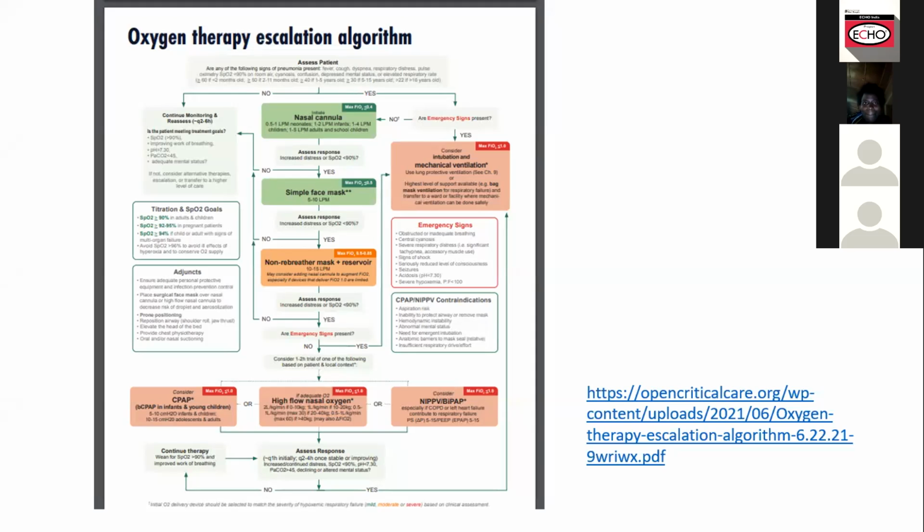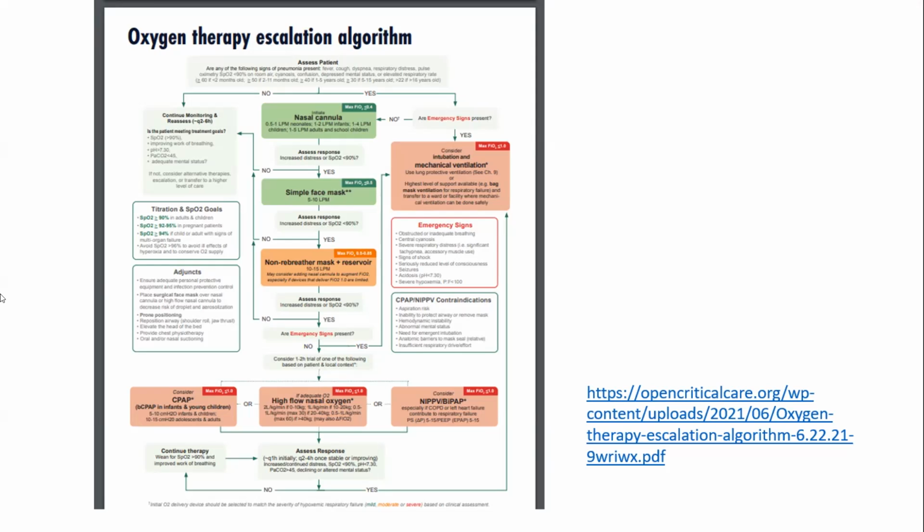It means you can go on mechanical ventilation immediately after seeing the patient is critically ill or having all those emergency signs. If not, you can go through this regular treatment: nasal cannula, simple facial mask, non-rebreather, and then the assessment. Really, remember you may not intubate your patient, and you leave those devices and start non-invasive pressure ventilation like CPAP and BiPAP. While using that, if we see our patients being helped or not, remember to make the assessment.